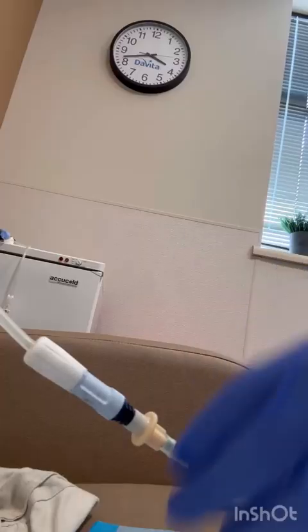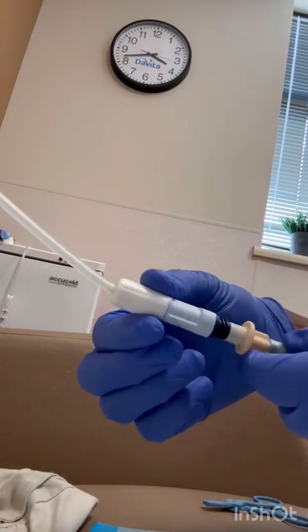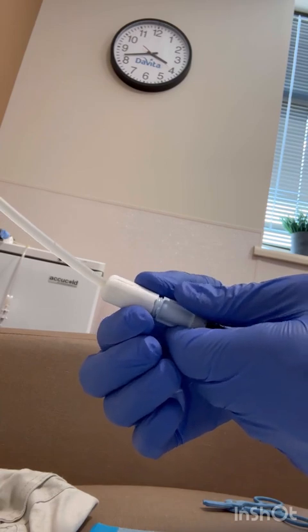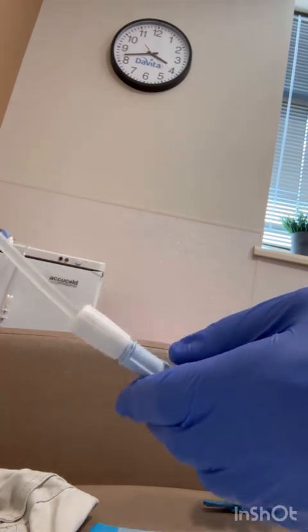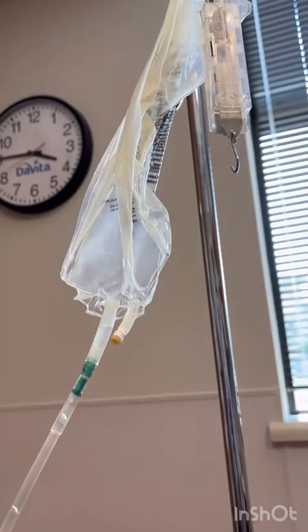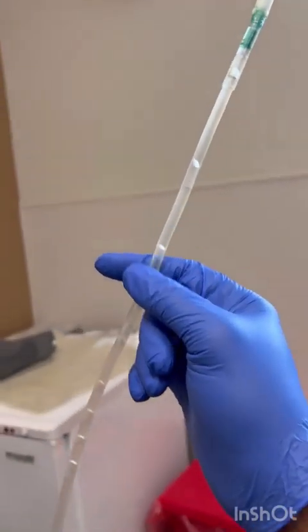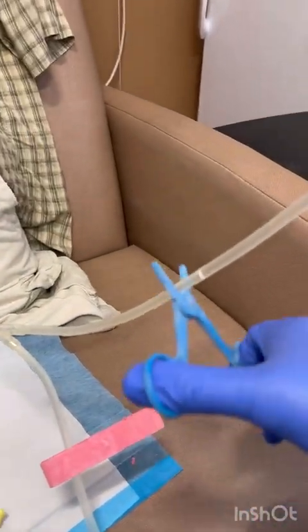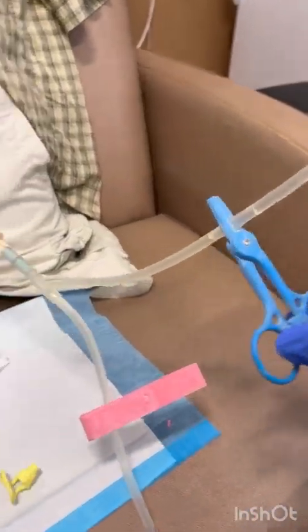Twist open — and there's Steve's belly getting filled, getting filled, getting filled. That brown stuff was iodine. That bag is now empty. The fill line will never be completely empty — there's always a little bit of fluid in there. Make sure you clamp that line so when you disconnect, it doesn't go squirting out everywhere.